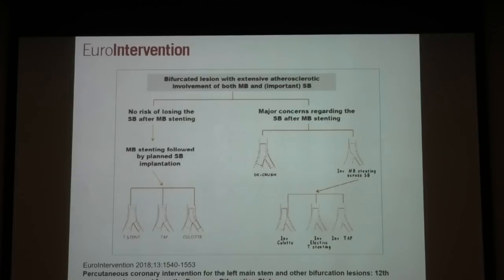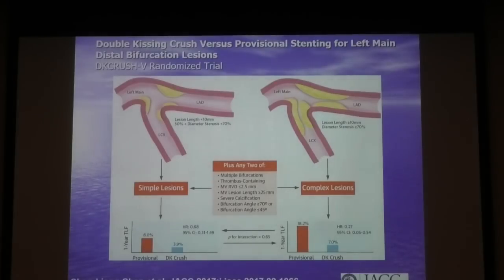خلينا نحكي على الدي كي كراش. DK crush is gaining momentum lately, particularly in left main stenting, because of data which is kind of good data, but not really excellent data.